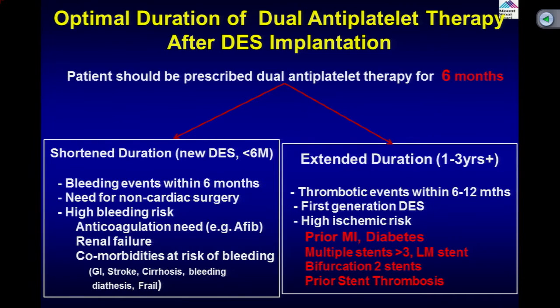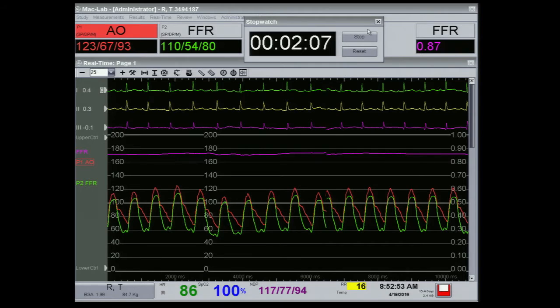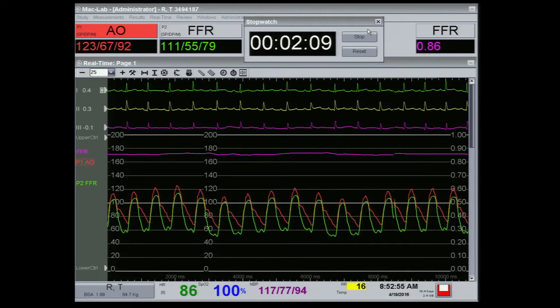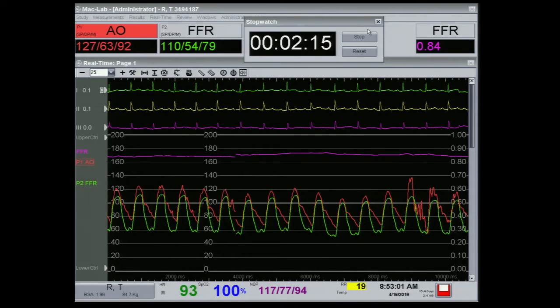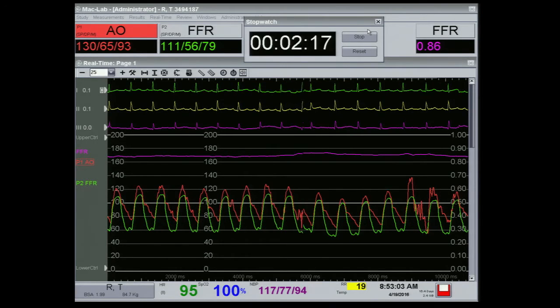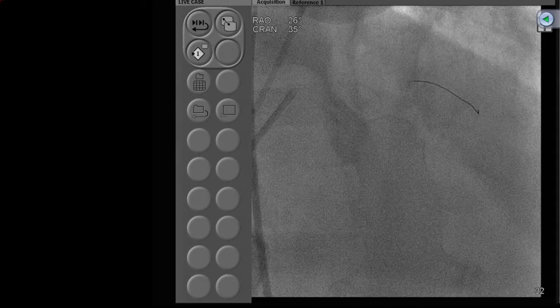We have the FFR of the diagonal — it went down to 0.83, stabilized at 0.81 as the lowest for the diagonal. Now let's go to the LAD. The resting reading is 0.80 — we don't even need adenosine for the LAD. 0.79. No need for any adenosine for the LAD. Our prediction was correct and now we are ready to do the OCT.